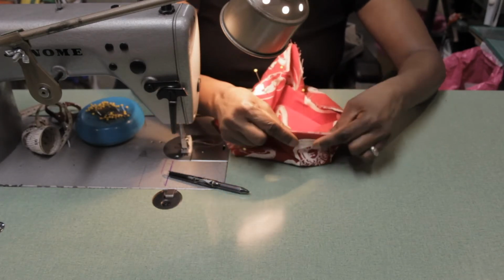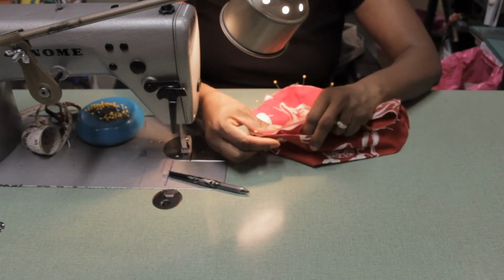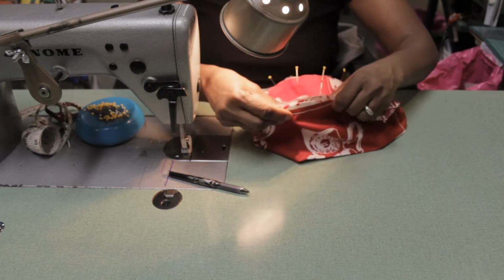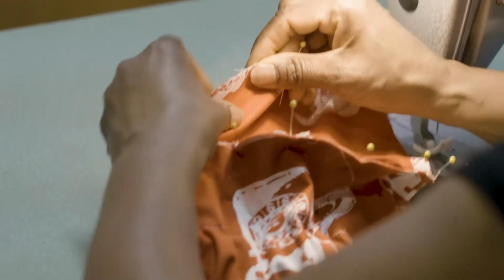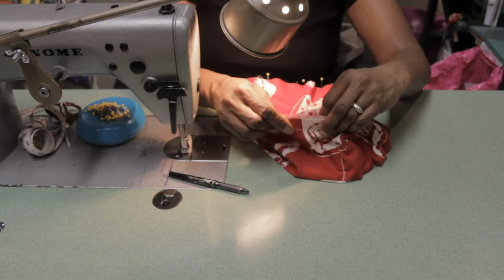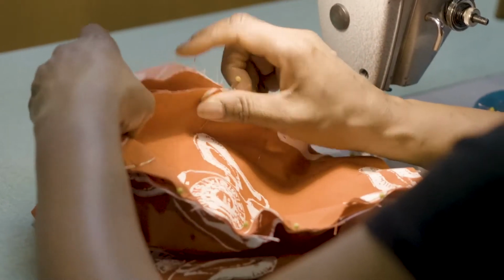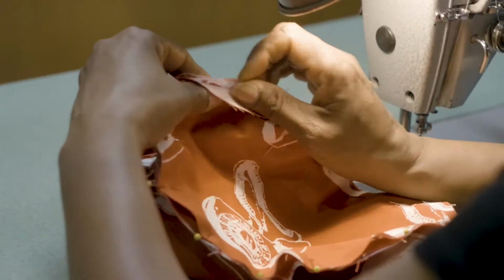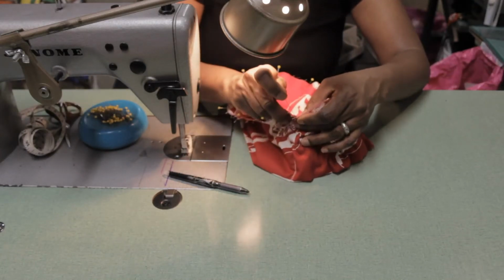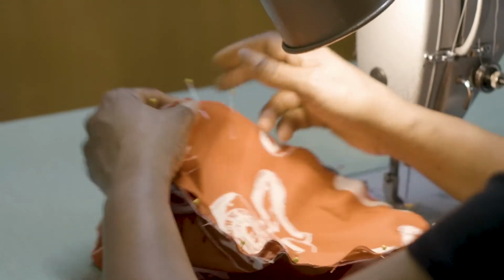So we're just pinning, and it should be pretty much the same size. You shouldn't have any puckers. And what I sometimes do is just kind of pull the two fabrics together so that they line up. Put as many pins as you think you need to make sure to hold everything together. And you're also trying to make sure that all of your edges line up too. You don't want anything too much different in your seam allowance, because you might end up missing some fabrics and end up with a hole somewhere.